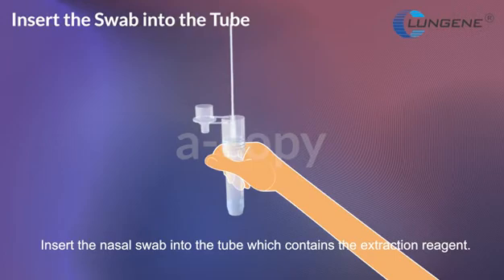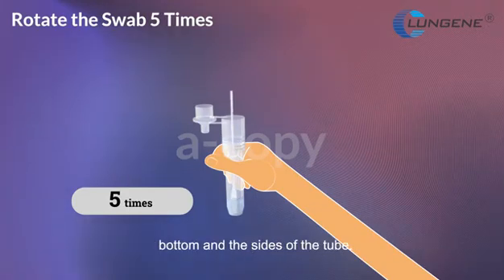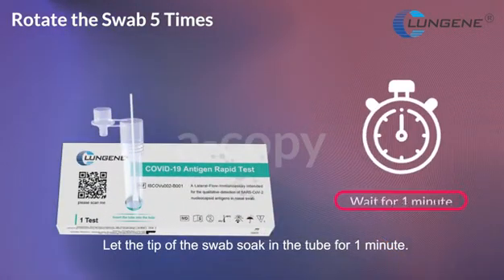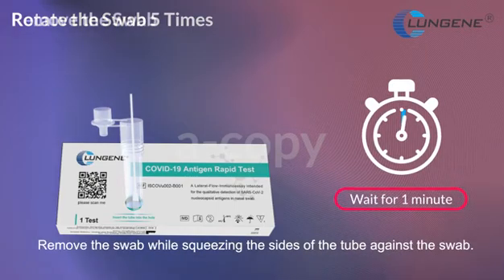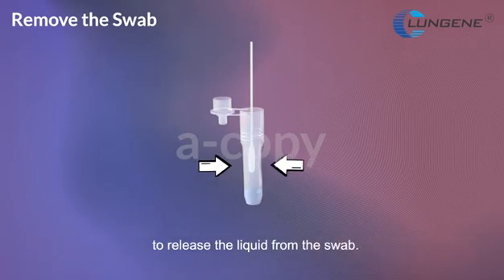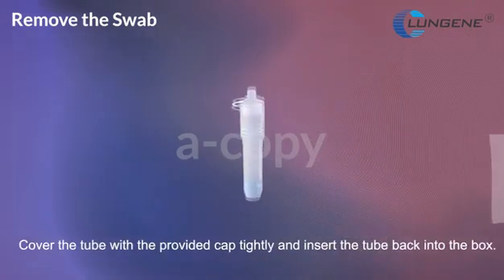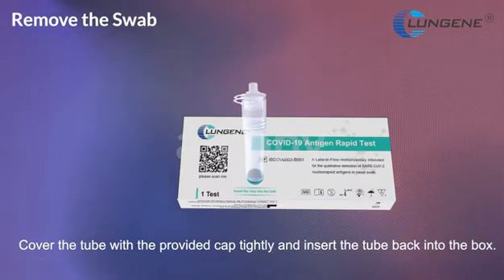Insert the nasal swab into the tube, which contains the extraction reagent. Rotate the swab at least five times while pressing the swab tip against the bottom and the sides of the tube. Let the tip of the swab soak in the tube for one minute. Remove the swab while squeezing the sides of the tube against the swab to release the liquid. Cover the tube with the provided cap tightly and insert the tube back into the box.